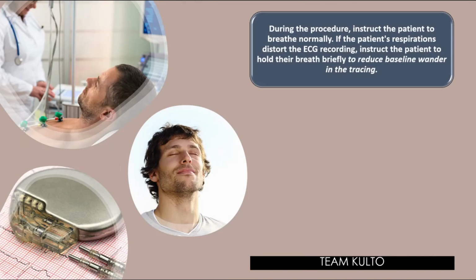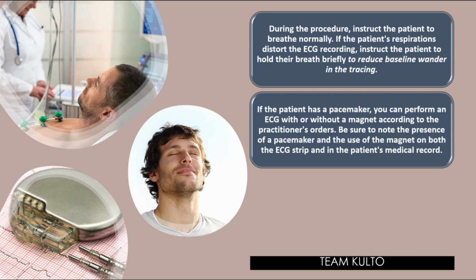During the procedure, nurses, instruct the patient to breathe normally. If the patient's respirations distort the ECG recording, instruct the patient to hold their breath briefly to reduce baseline wander in the tracing. If the patient has a pacemaker, very important though, you can perform an ECG with or without a magnet according to the practitioner's order. Again, i-verify mo pa rin ang doctor's order mo, lalo na sa mga pasyenteng may pacemaker.